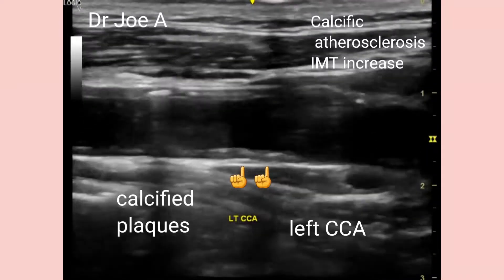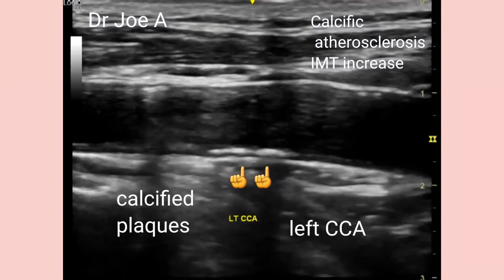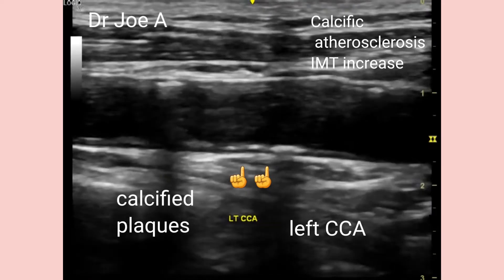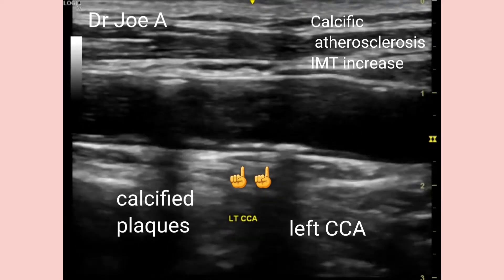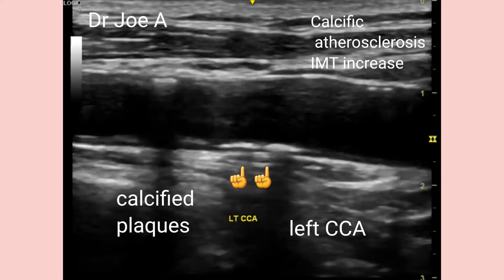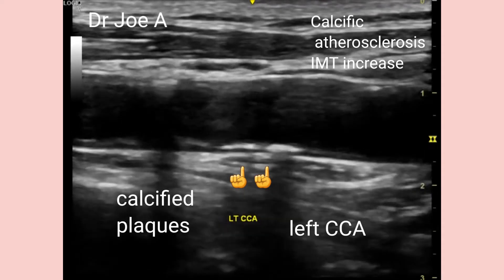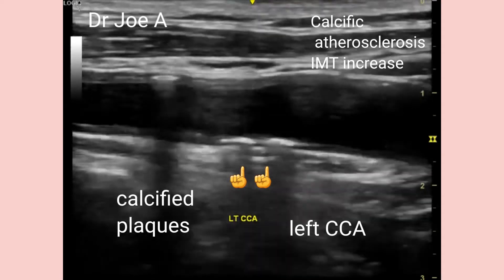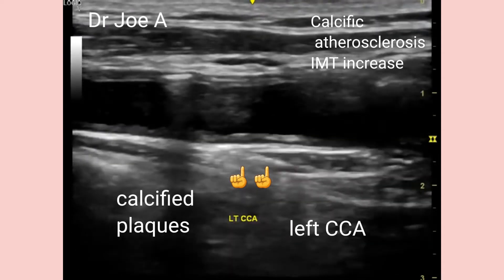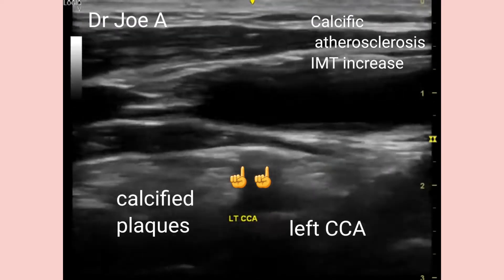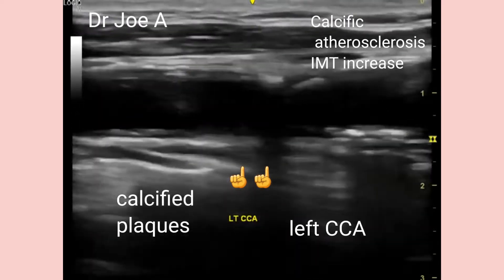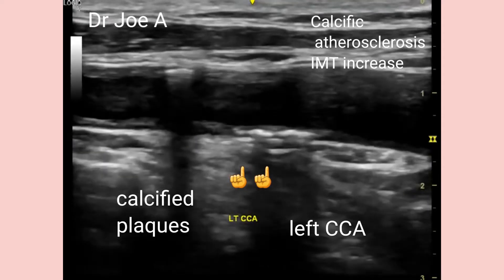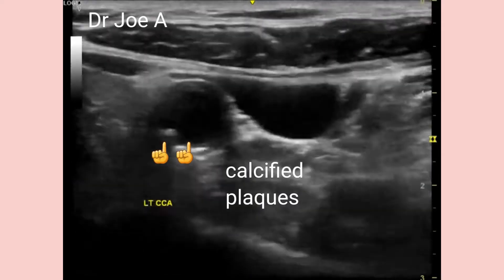This is an elderly male patient with sudden unilateral loss of vision. The left common carotid artery on B-mode ultrasound shows extensive calcific atherosclerosis and increase in intima medial thickness. In this case, the IMT or intima medial thickness varied from 1.2 to 1.4 mm.